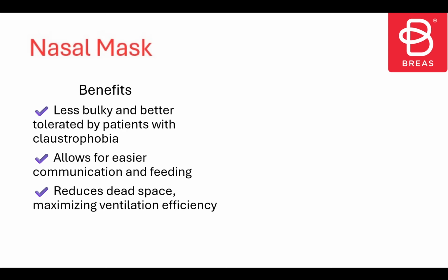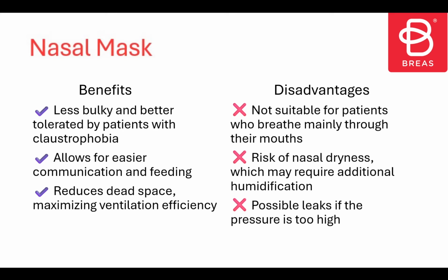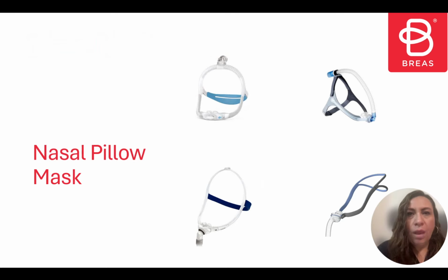But there are also disadvantages. Sometimes they are not suitable, especially for patients who breathe with their mouth open. Because of the risk of nasal dryness, additional humidification may also be required, and there may be leaks if the pressure is too high. We're going to go from the smallest to the largest in that sense.